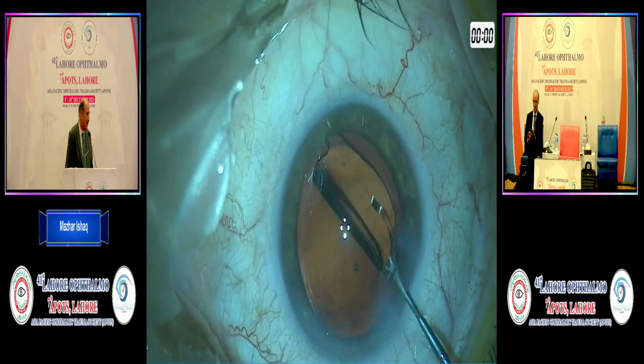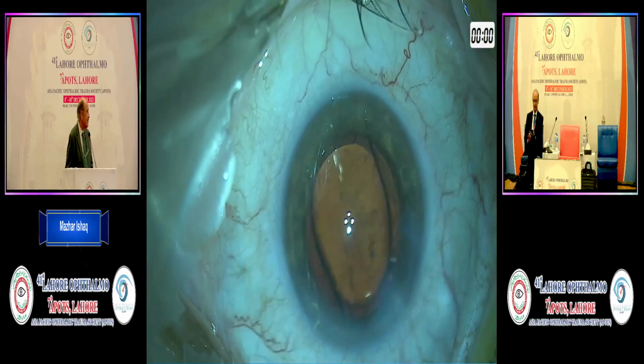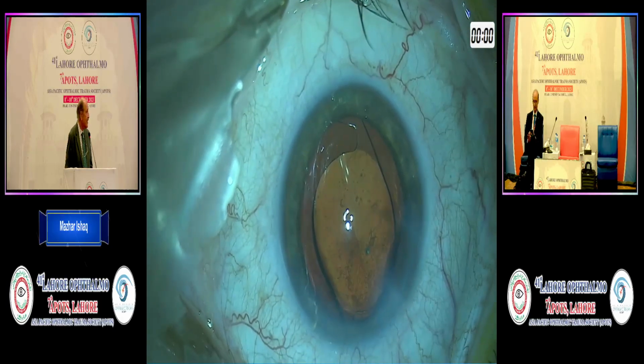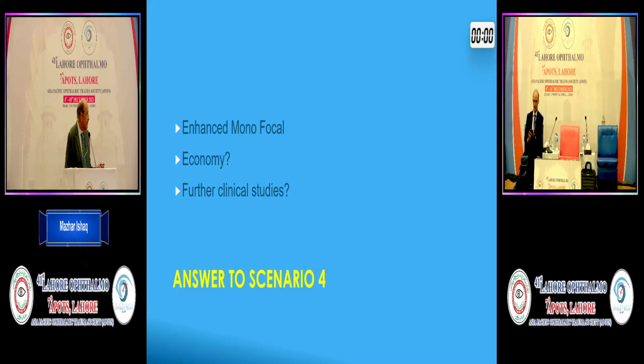And in my post-operative results, I haven't found any of my patients coming with a problem of glare or night vision problems. Intermediate vision is good, but still it's important to know about the three questions I want to ask: the economy and future clinical studies. Yes, this is going to be coming up even in the Western world. Still, the papers are in progress.